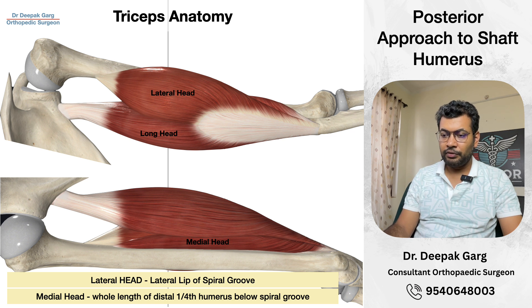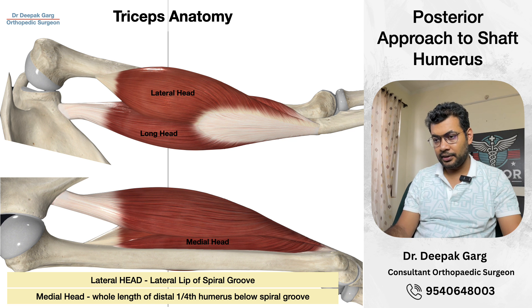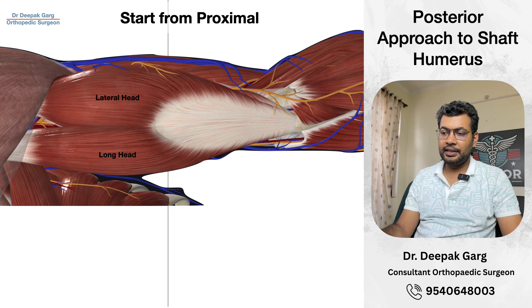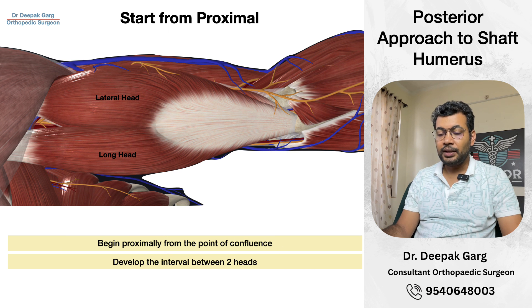Once we identify the confluence, we will incise it. We will cut the tendon in line with the skin incision and separate the tendon with scissors, then we will have the muscle. We keep separating the individual fibers of the muscle with scissors, keeping in mind that the nerve is coming from the medial side along the spiral groove, so we go towards the lateral. It is better to begin proximally and identify the point of confluence before incising the triceps, as this helps identify the radial nerve more easily with less chance of injury.